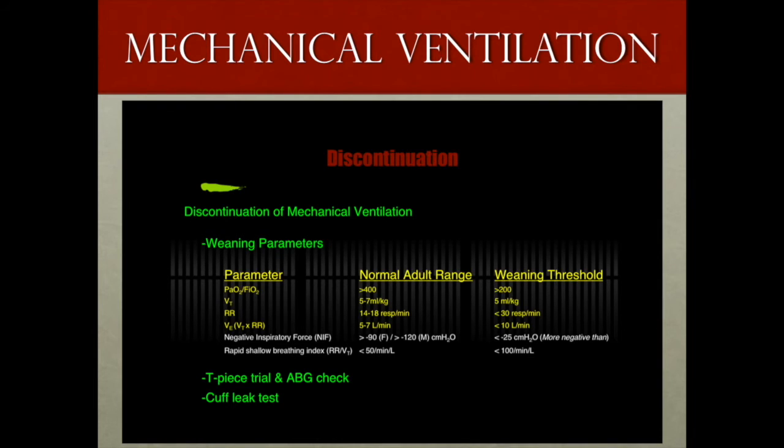The weaning parameters are very dependent on the respiratory therapist obtaining them and their ability to educate the patient and have the patient be comfortable, calm, and cooperative when they're being obtained. So they can be very user determined, meaning you can have poor weaning parameters if the process is rushed or done inappropriately, and be led to believe falsely that the patient has a high likelihood of failing.